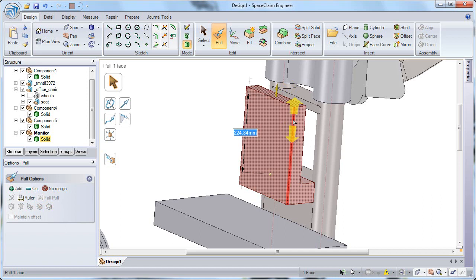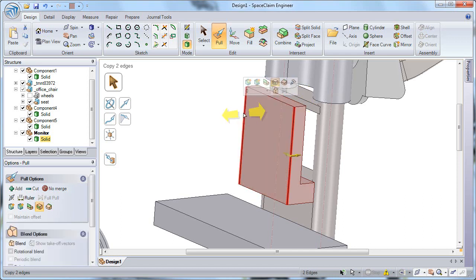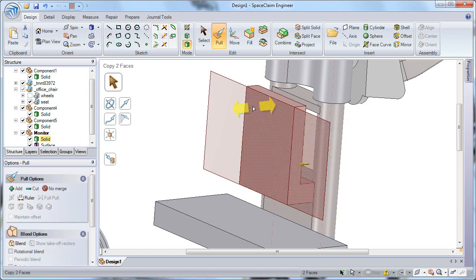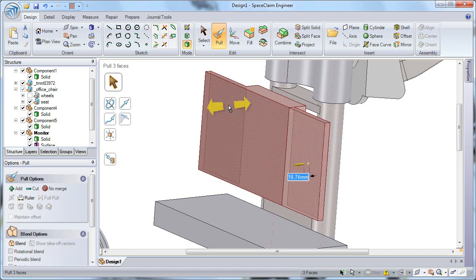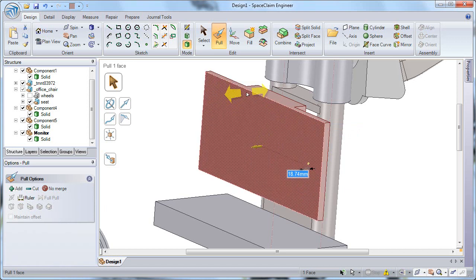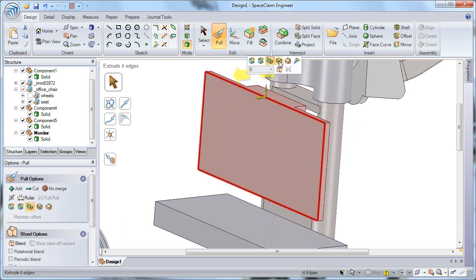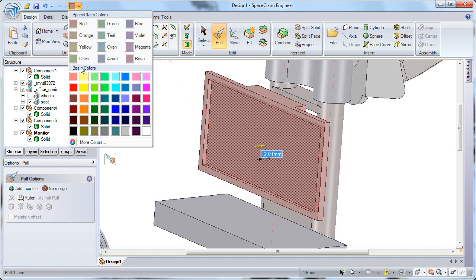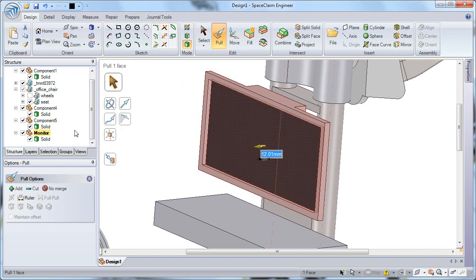I can select on the two edges on either side of this solid, choose the Extrude Edge option, extrude both out sideways simultaneously, creating two new surfaces, and then select on each of my three faces and pull those out to add depth. I can then double click on an edge of this monitor to copy edges inward, again selecting on the direction I'd like to copy them, and then select on that newly created face, pull that in to create our monitor screen. With that screen still selected, I can go up to my Color tool in the Quick Access toolbar and change it to a black display.